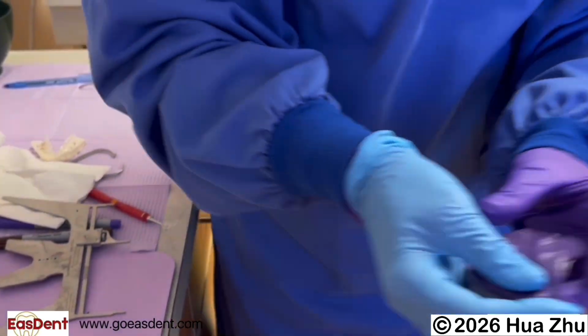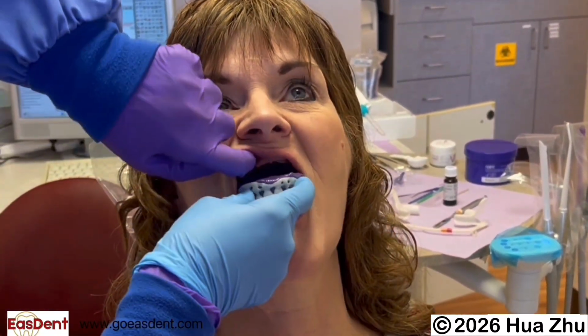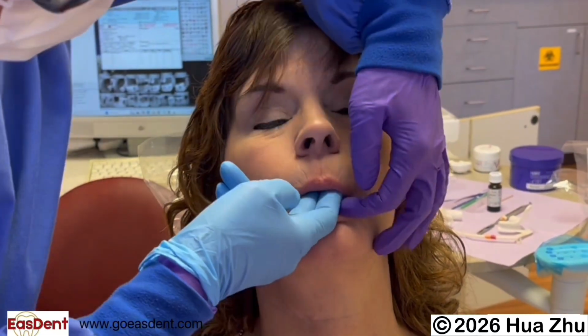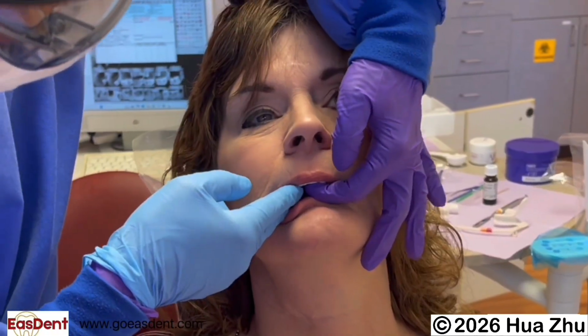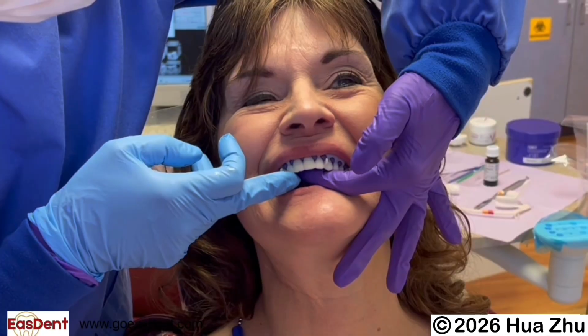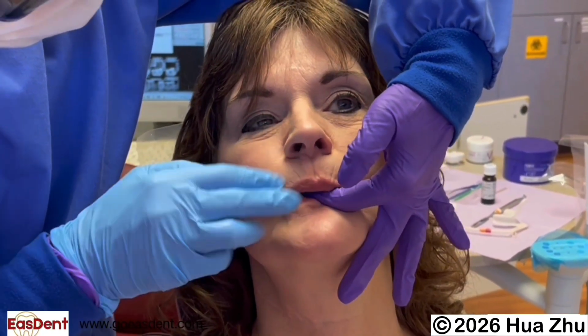The amount should correspond to the space between the tray and the tissue when the tray is positioned at the ideal tooth position. When you seat the tray, some material might be pushed to the border. Align the midline of the maxillary anterior teeth on Easdent tray to the midline of the face.